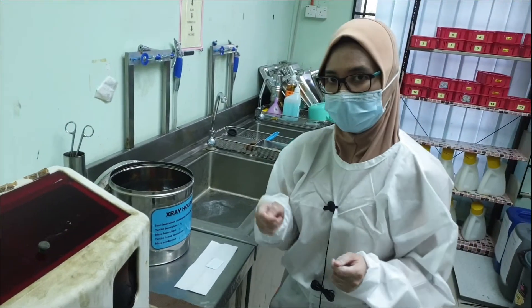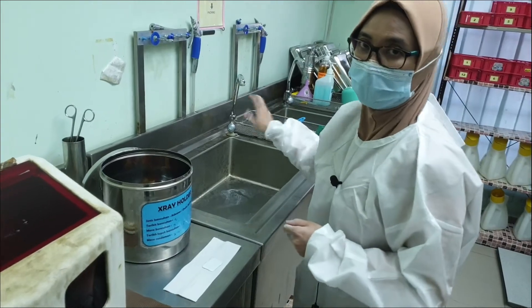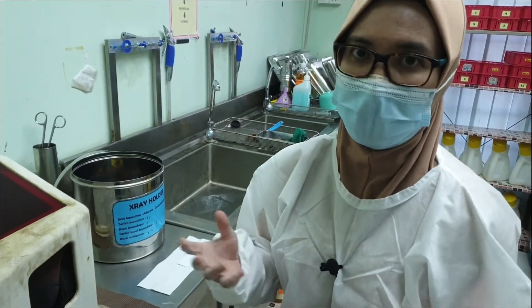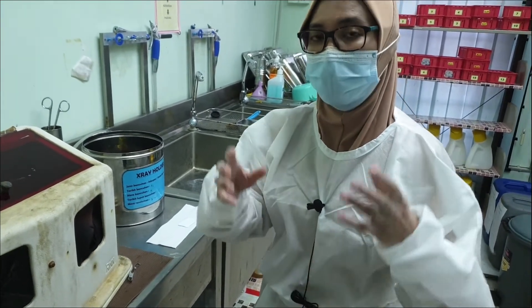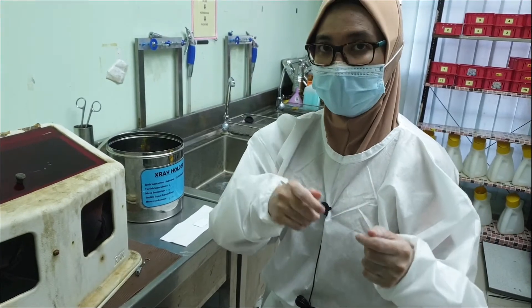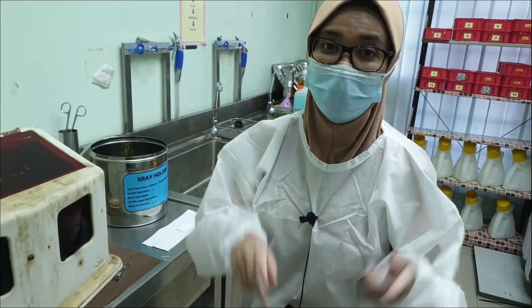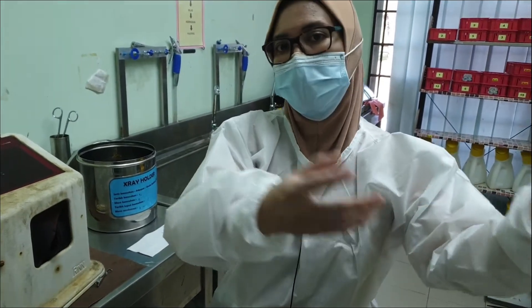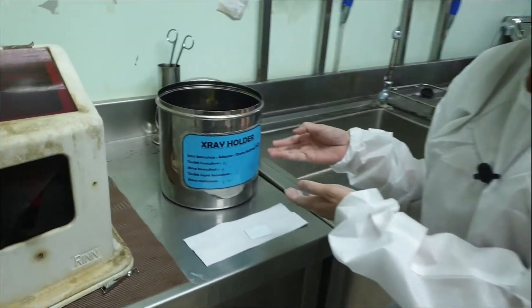Once you're happy with the x-ray film, take it out, wash it with tap water, and then bring it to the clinic for drying. Also, I would like to remind all of you to get the x-ray holder — whether it's the blue, yellow, or red one. After you use it in the x-ray room, you should bring it here and place it in this disinfectant solution.